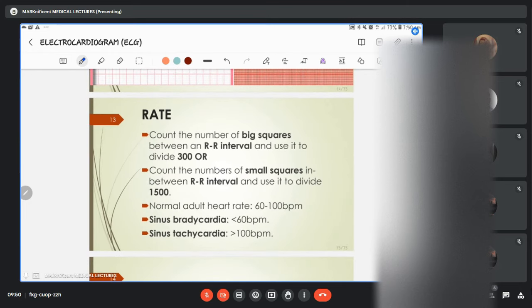So there's what we call the rate also. Just like you have heart rates, that is what you have here. All of these things we measure, we use machines to measure this, or you can count the pulse, the radial pulse, the femoral pulse, popliteal, carotid pulse, and all of those things, or brachial pulse. But this is now bringing what you actually do into practice, like how those values are being gotten.